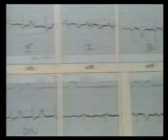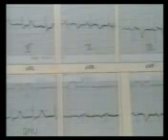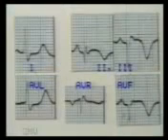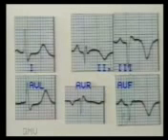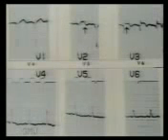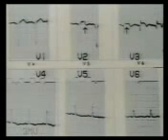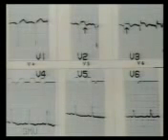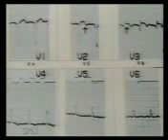This ECG shows leads 2, 3, and AVF with slight ST elevation and deeply inverted symmetrical T waves, indicating an inferior wall infarct which is 2 to 3 weeks old. Note the reciprocal tall T waves in leads 1 and AVL. This T wave inversion persists for 2 to 3 months. In this ECG, the chest leads show ST elevation in V2 and V3 only, indicating a small anterior septal infarct. It is about 2 to 3 days old as the T wave has started inverting.